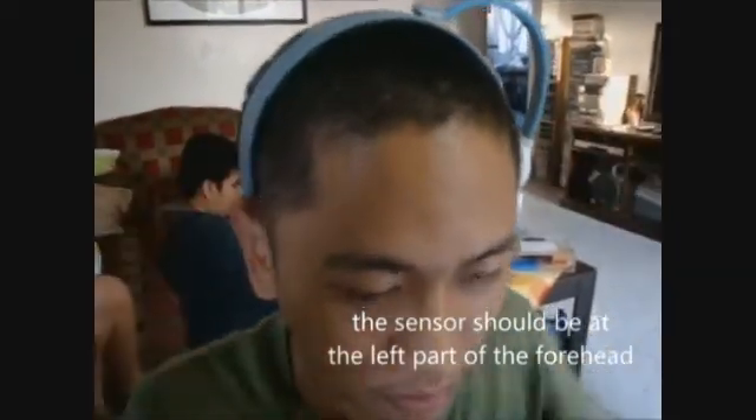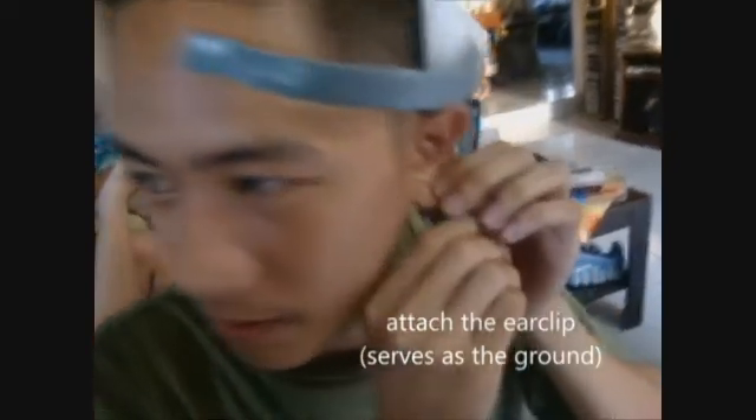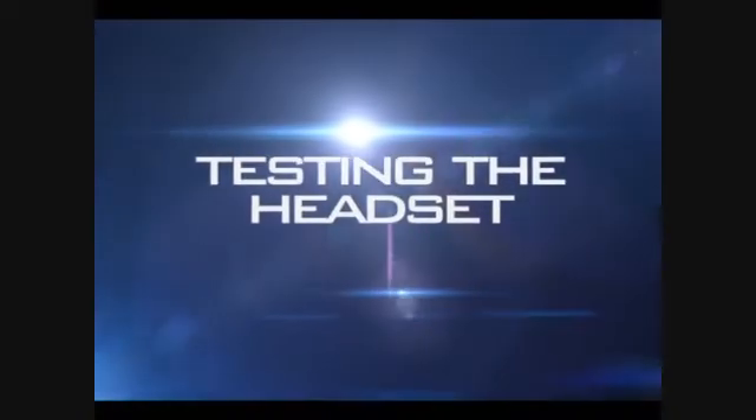How to wear the headset. First, insert the AAA battery properly. After inserting it, close it. Then, for the headset, make sure that the sensor is properly placed on the forehead. Then attach the ear clip. Check for the fit. Test if the headset is properly placed, and make sure the headset sensor touches the forehead skin. Then turn on the device.